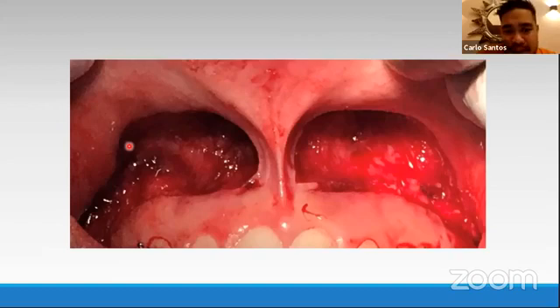So when we reach this step, you remember, as you can see, the bleeding is controlled because we're in the fascia area. You can see the fascia, and because of what I said, the slow motion in depositing your solution, you create a very good and stable hemostasis.